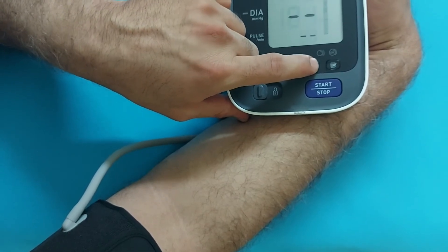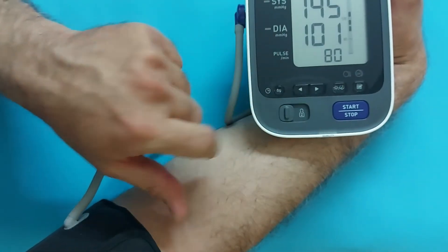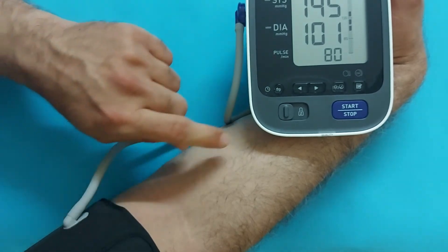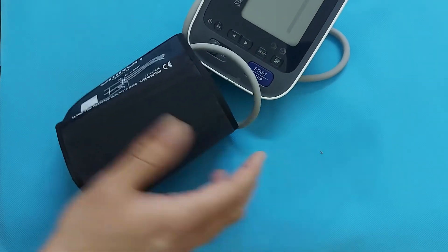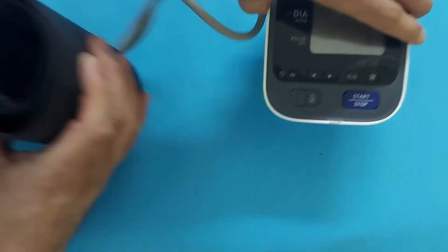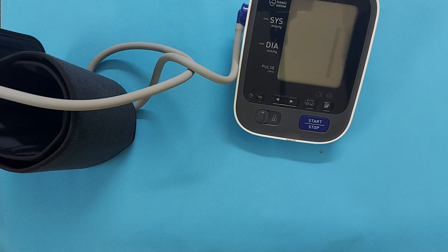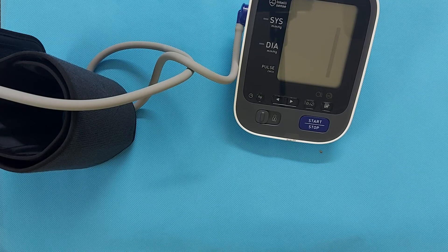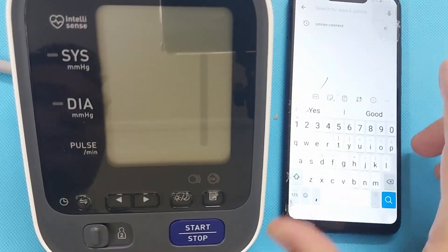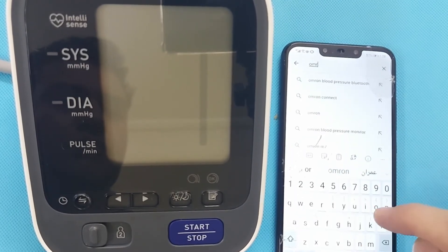Next in this video, I will connect this Omron M7 to the mobile app so we can discuss with our physician anytime in the clinic about blood pressure. There is also an option in this Omron M7 to measure blood pressure in the morning and in the evening, and that data will be saved with a morning or evening label. Open the Play Store or App Store and search for Omron Connect.